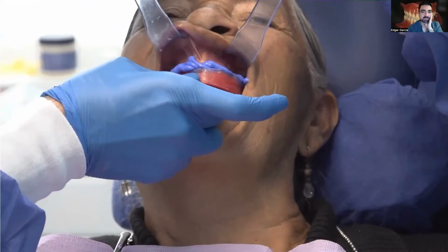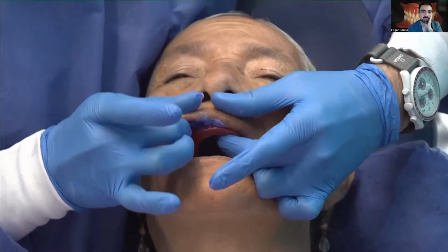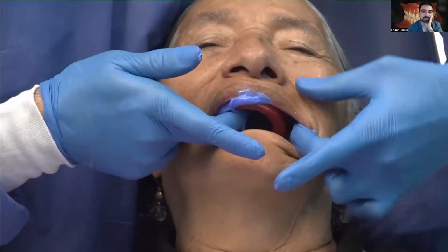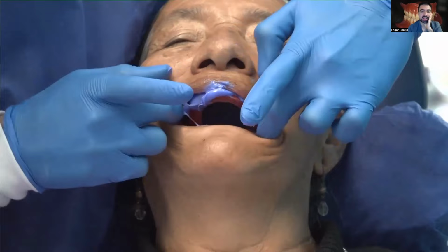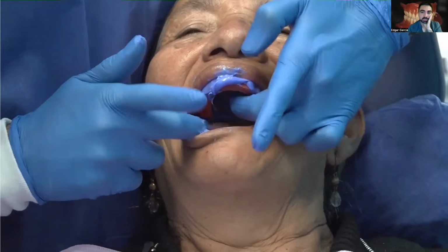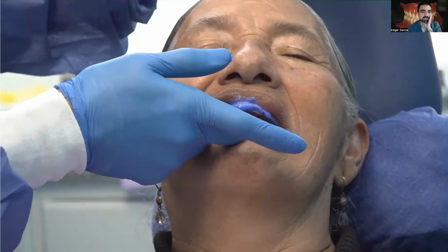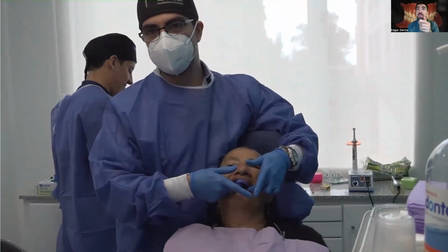So as you can see, everything I like to do is with retractors. I pull the buccal mucosa in the front, on the side, and also I ask the patient to move the jaw from right to left to avoid the condyle. The coronoid process, I think, right? Exactly. So you get an impression of that area, of the movement of the coronoid process also. Exactly. So as you can see, I don't think there's a big difference from the techniques that we are used to doing. But I do this before the bite rim adjustment.